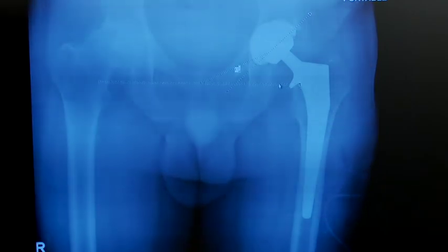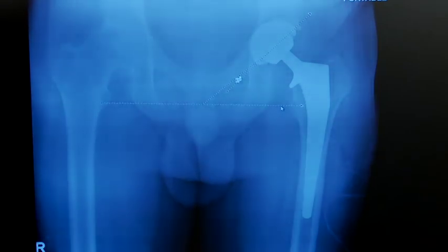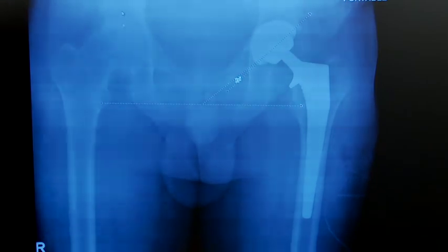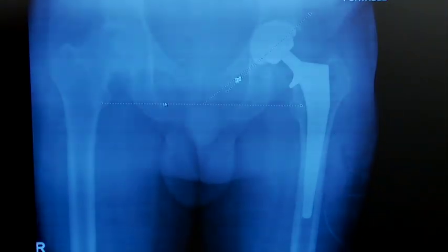Then I'll look at my limb lengths by taking that trans-teardrop line and dragging it down, and I can see that I'm probably about 5 millimeters long on this side compared to the other, which gives me nice room to take the other side and bring him down to account for the significant wear and collapse that he's had through the AVN on this side, and get this hip lined up with the other side and hopefully restore his anatomy to match the side that we just did. And I think we can do that very much within reason, as we lengthened this side quite a bit and he still was not very tight at the end of the case.